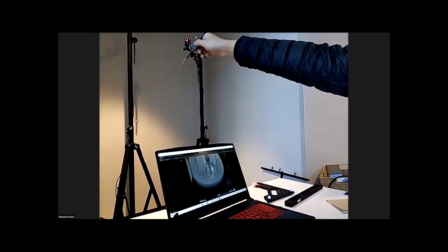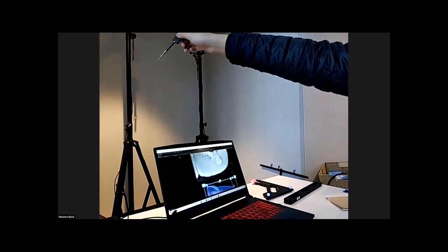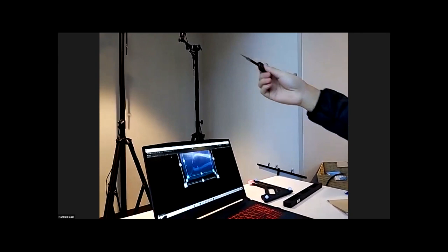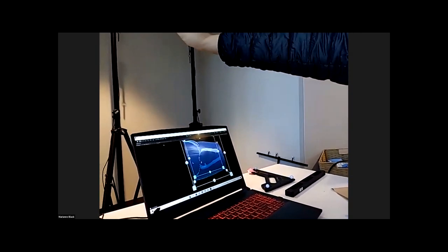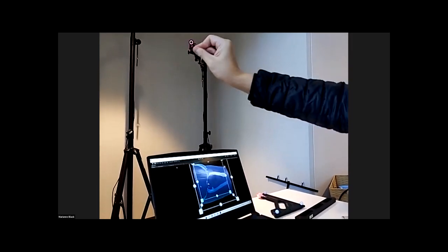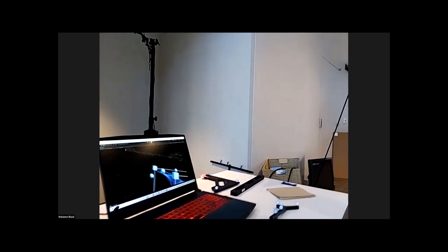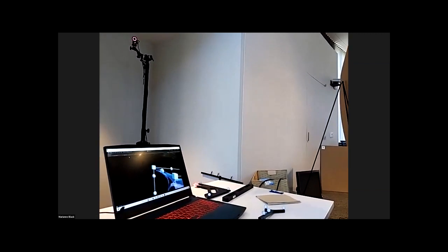All right, and then based on the position of the tip of the needle, as we move it, we update the MR scan above the segmentation. And we can also use hand manipulation to move the segmentation to overlay it to the physical patient body. So this segmentation is a representation of the patient's thigh. We're able to scale it and move it.